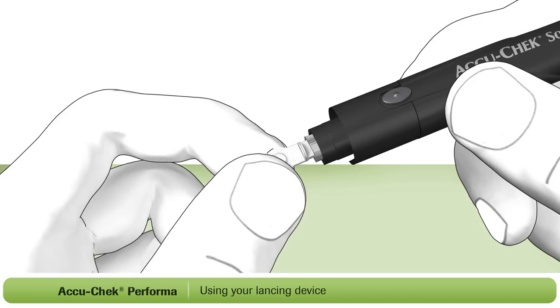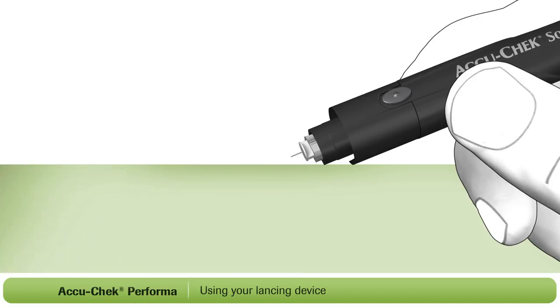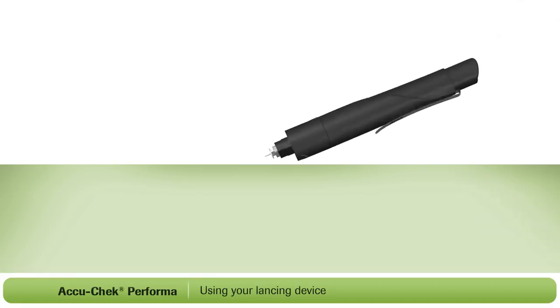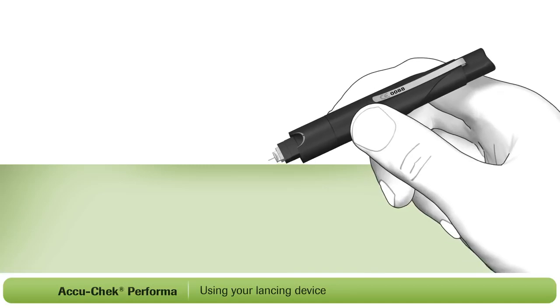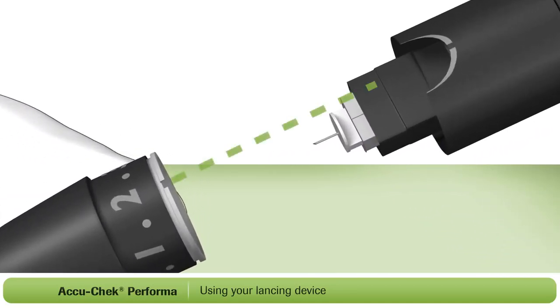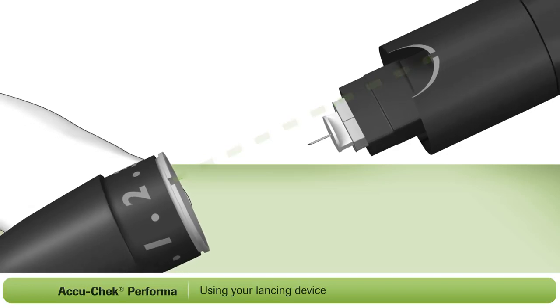Twist and remove the protective cap from the lancet to expose the needle. Place the cap back on your lancing device. Be sure to align the notch of the cap with the mark as shown.